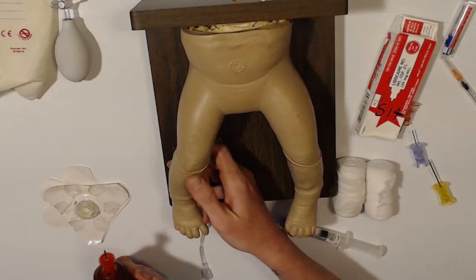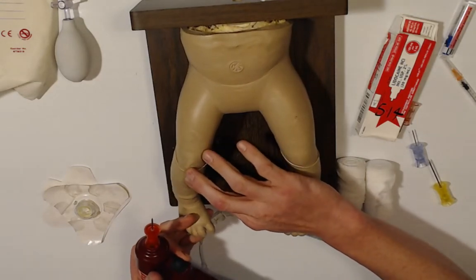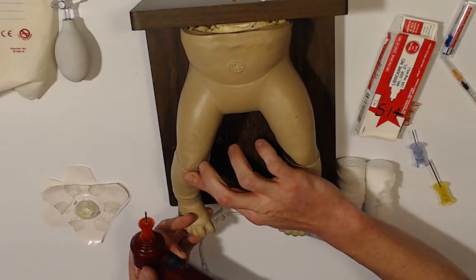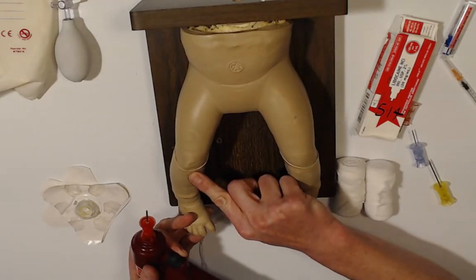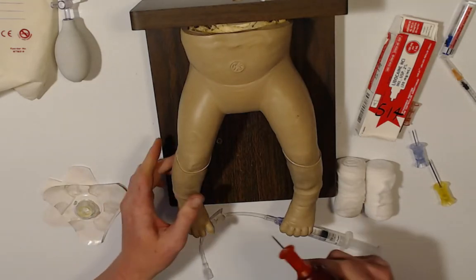Okay, so I'm going to palpate. We want to go, again, just below the knee. You may or may not be able to feel that tibial tuberosity on an infant. Usually it's pretty hard to feel. So we're going to go about 1 centimeter down, and of course we want to go medial as well, okay? Again, clean my site. I got my IO.